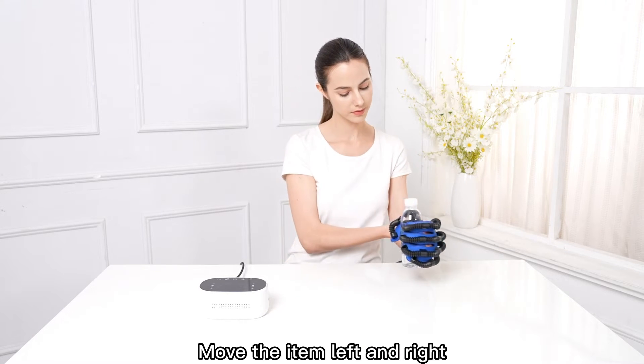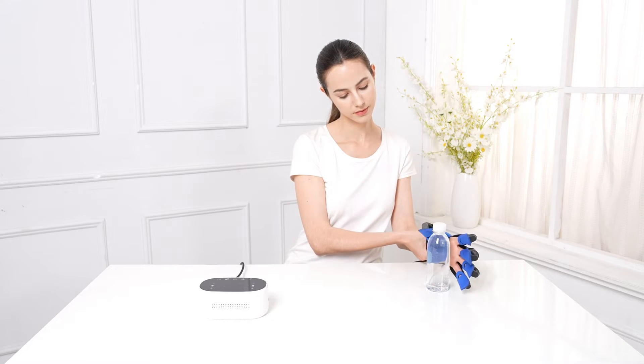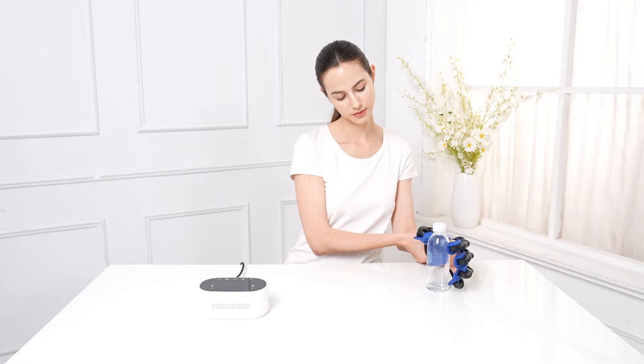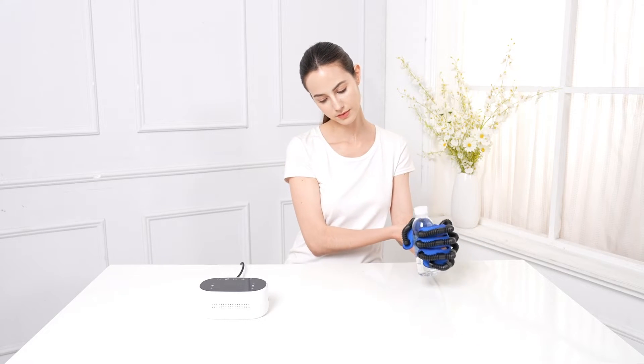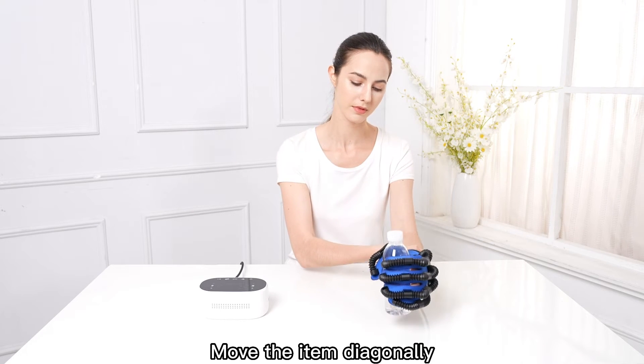Move the item left and right. Move the item diagonally.